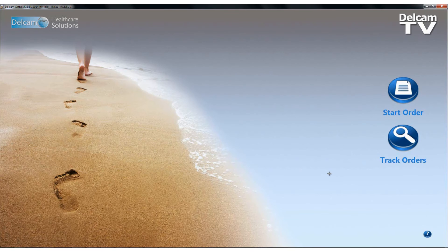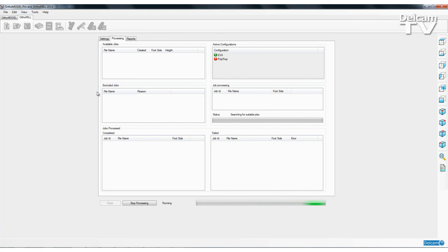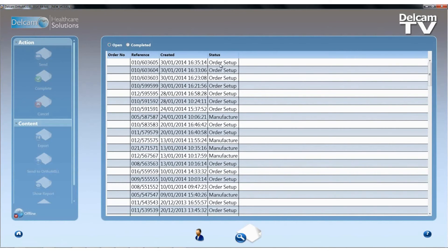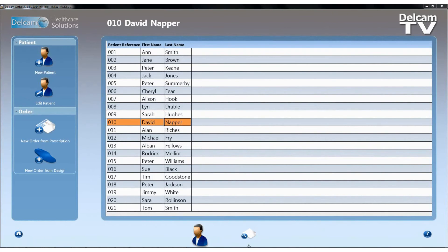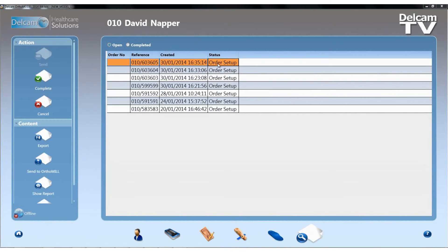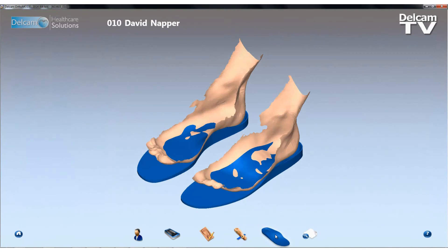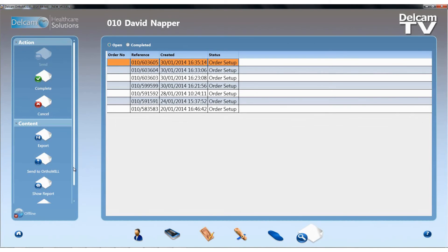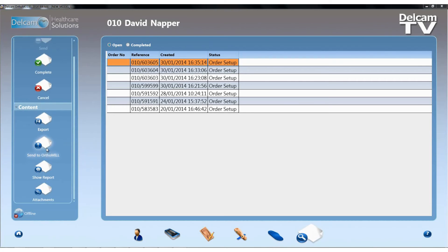In this video I'm going to demonstrate some of the new features added into OrthoMODEL 2014. I've got OrthoMODEL and OrthoMILL Pro running simultaneously. OrthoMILL Pro 2014 is running in background batch config mode, meaning it's sitting there looking for polypropylene and EVA designs ready to machine. I'm going to hit the Track Orders button and select an order for a patient that has already been created. I'll come to the Orders section and you can see this particular order — when I open it up, I've got a pair of custom orthotic insoles created for this patient. The new feature on the orders page is that we can now hit the Send to OrthoMILL button.